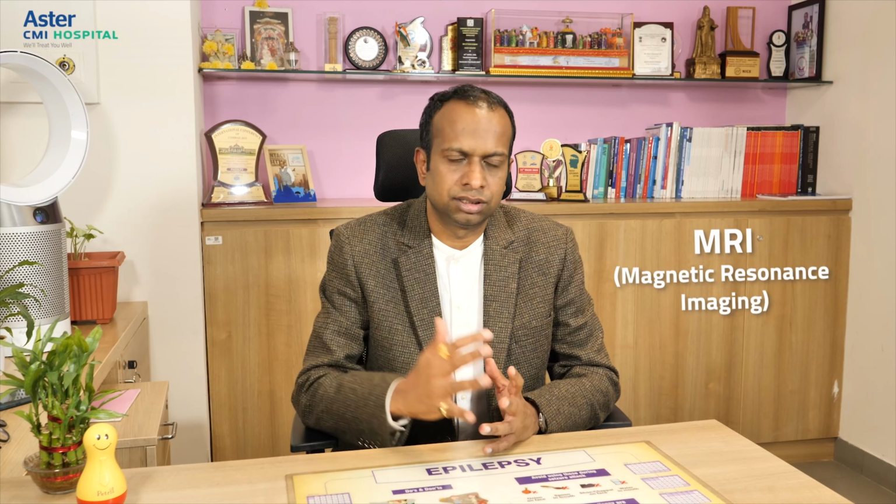MRI we prefer, especially in children, especially where we need to do fine detailed analysis of the brain structure, brain or spine, or even other organs. First of all, there is no side effect or radiation. It gives you very high quality detailed imaging. This is very important when somebody might have had a brain tumor, then the person has to get operated, so you need clear-cut imaging. Similarly, with epilepsy, the abnormalities are usually very subtle and you cannot always pick them up on CT.